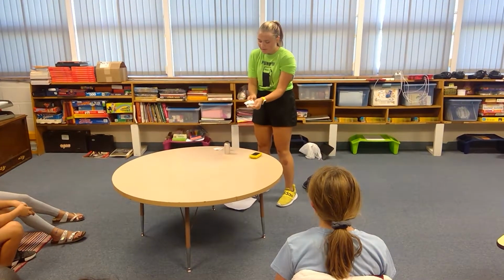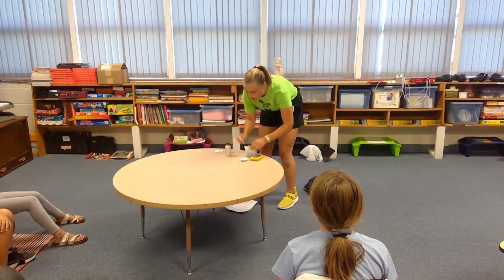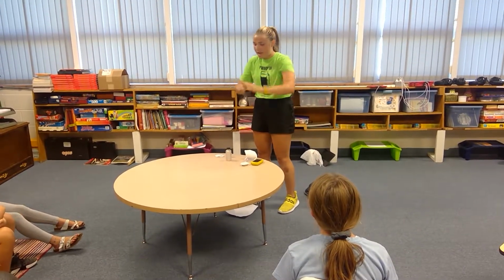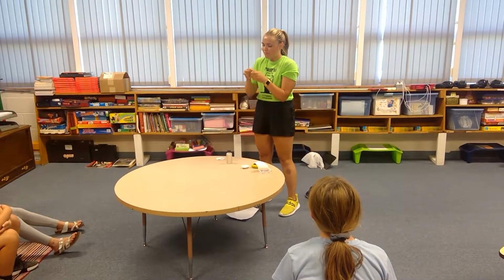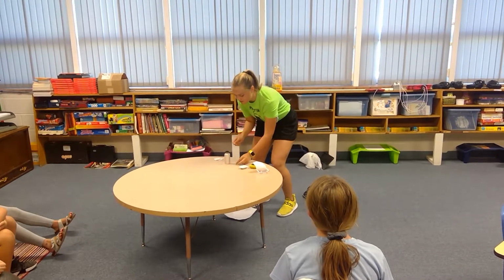So we're going to open this up, just like this one. And also what comes with it is a cap and a syringe. So we're just going to screw those together. And this is how we're going to put the insulin into the pod. So this is insulin, and this is 1,000 units of insulin, and I'm only going to use 150.